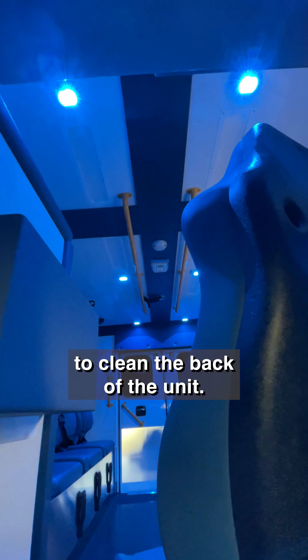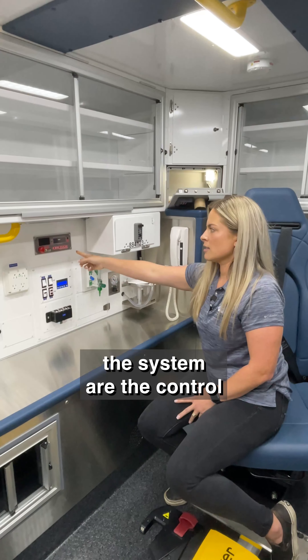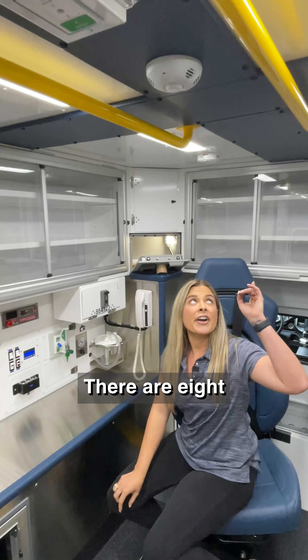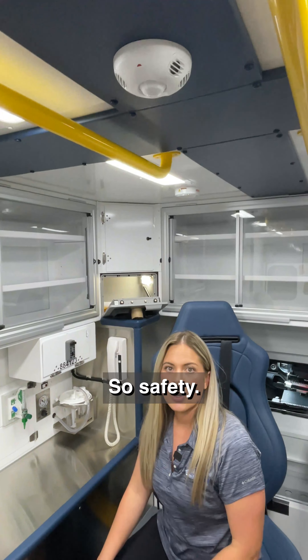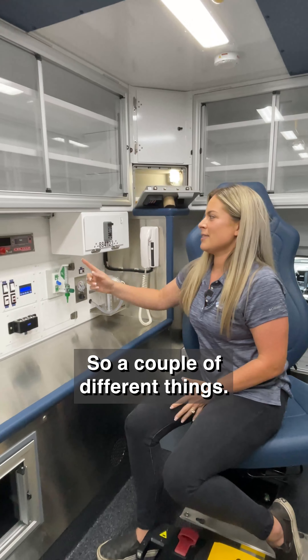So what is this system? In short, this is a really easy, convenient, hands-free way to clean the back of the unit. The components of the system are the control head itself here at the action wall. There are eight lights in the ceiling raceway and then there's also this motion sensor here.